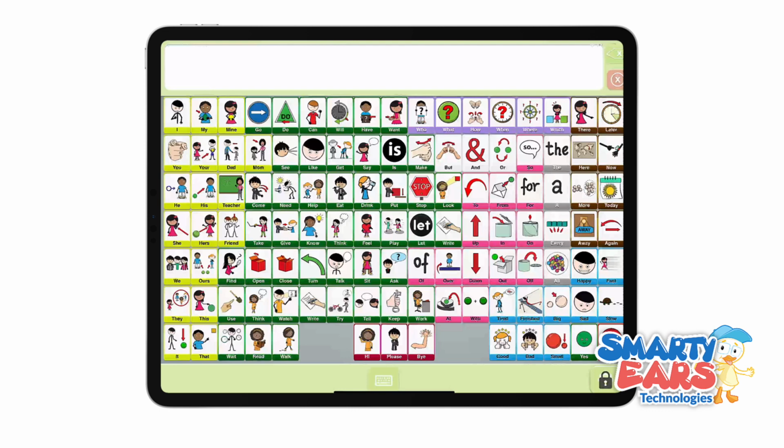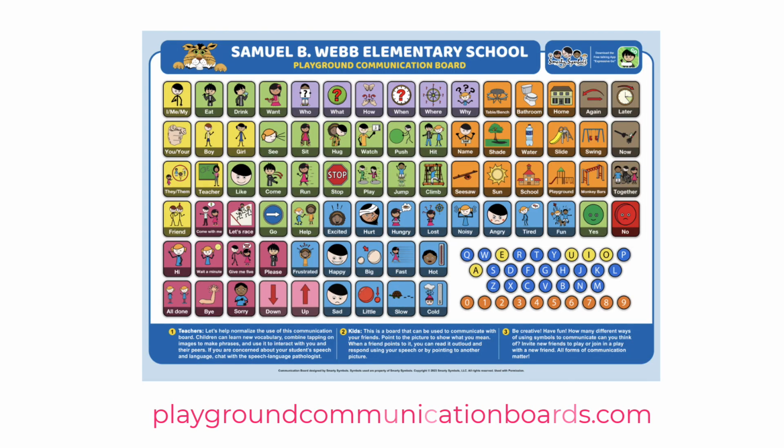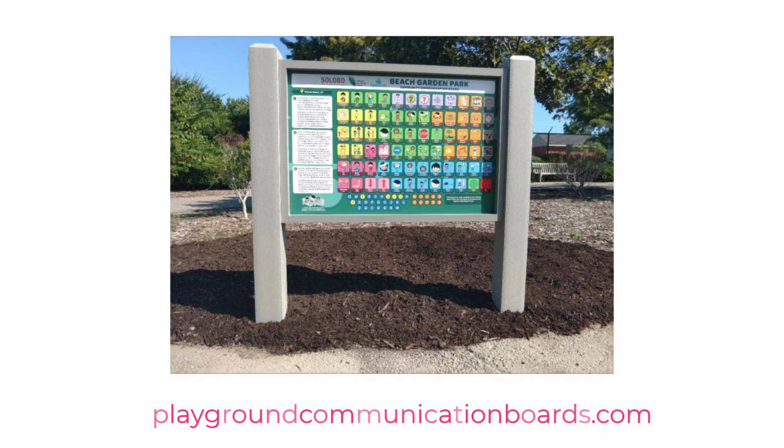It's available on the App Store for both iPads and iPhones, free to use with all of Smarty Symbols' public display communication board screens.